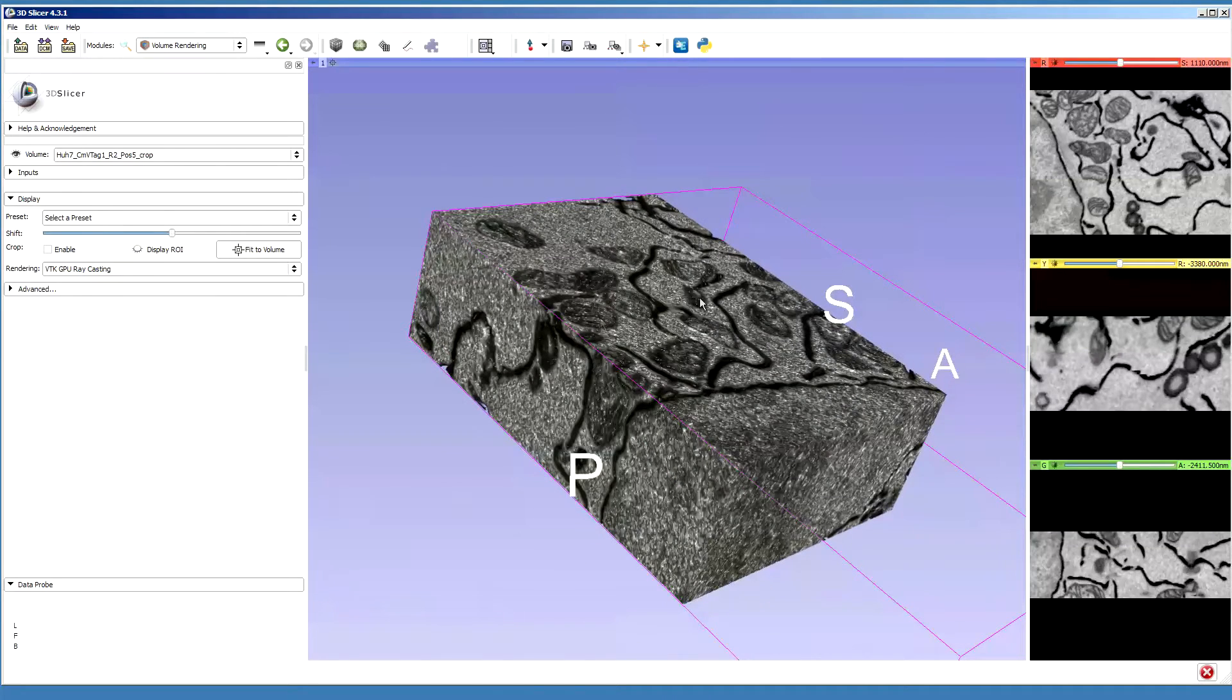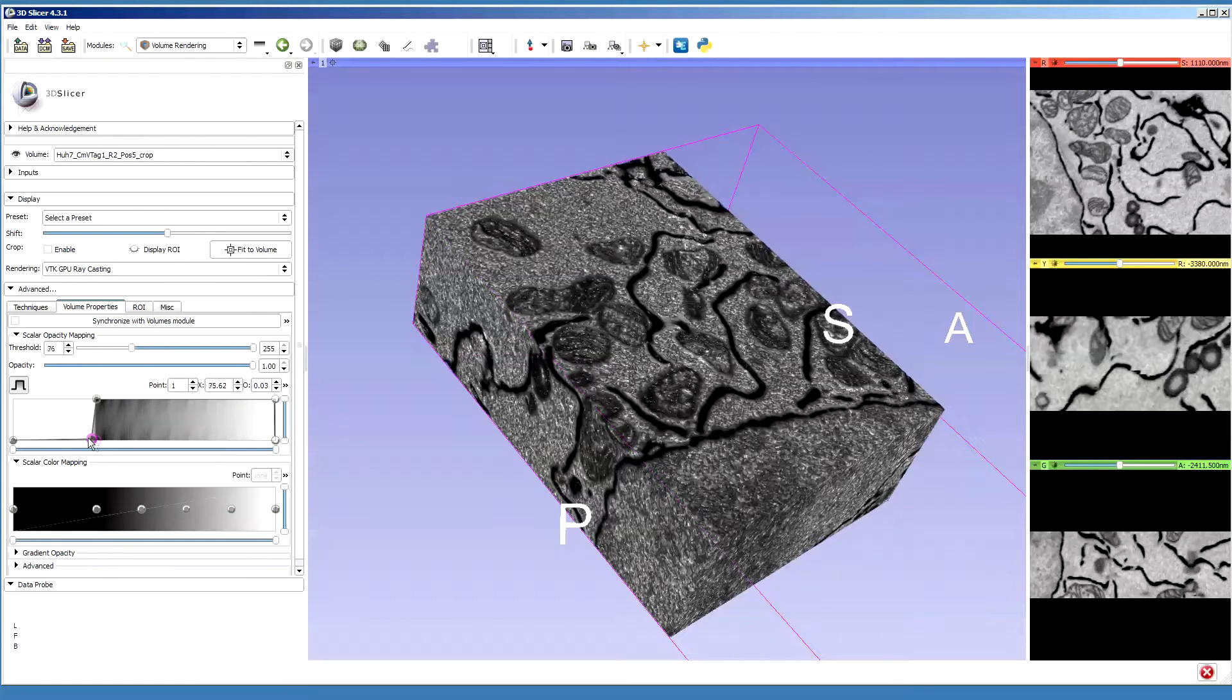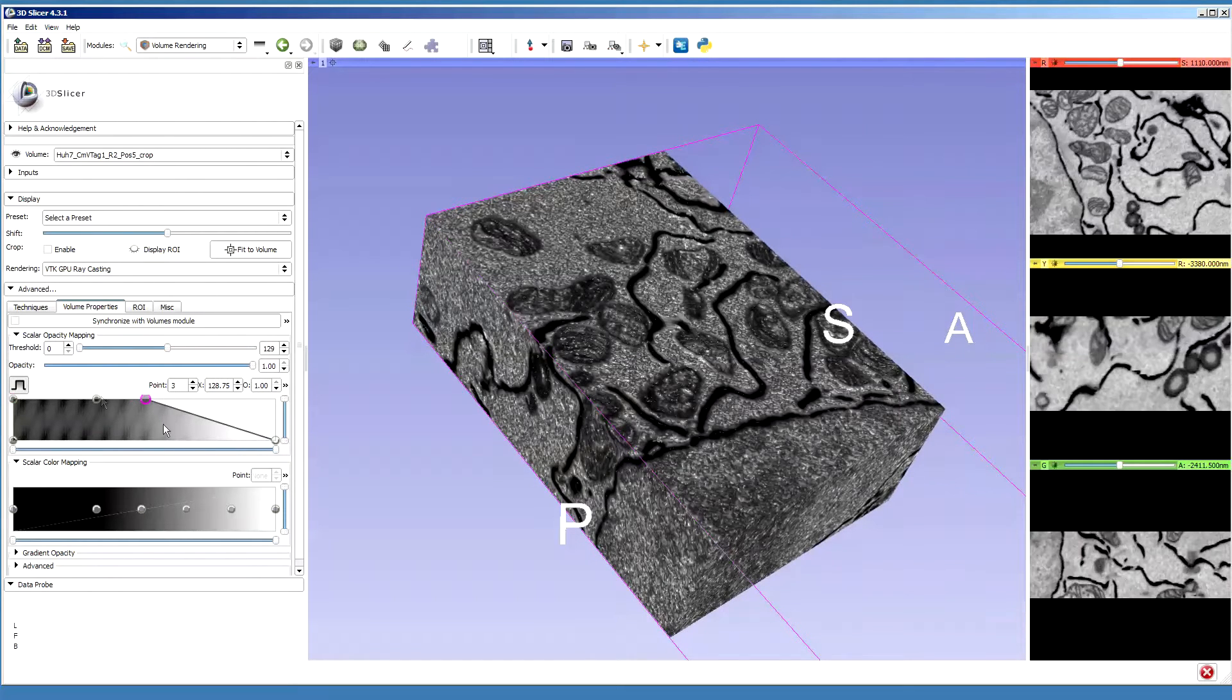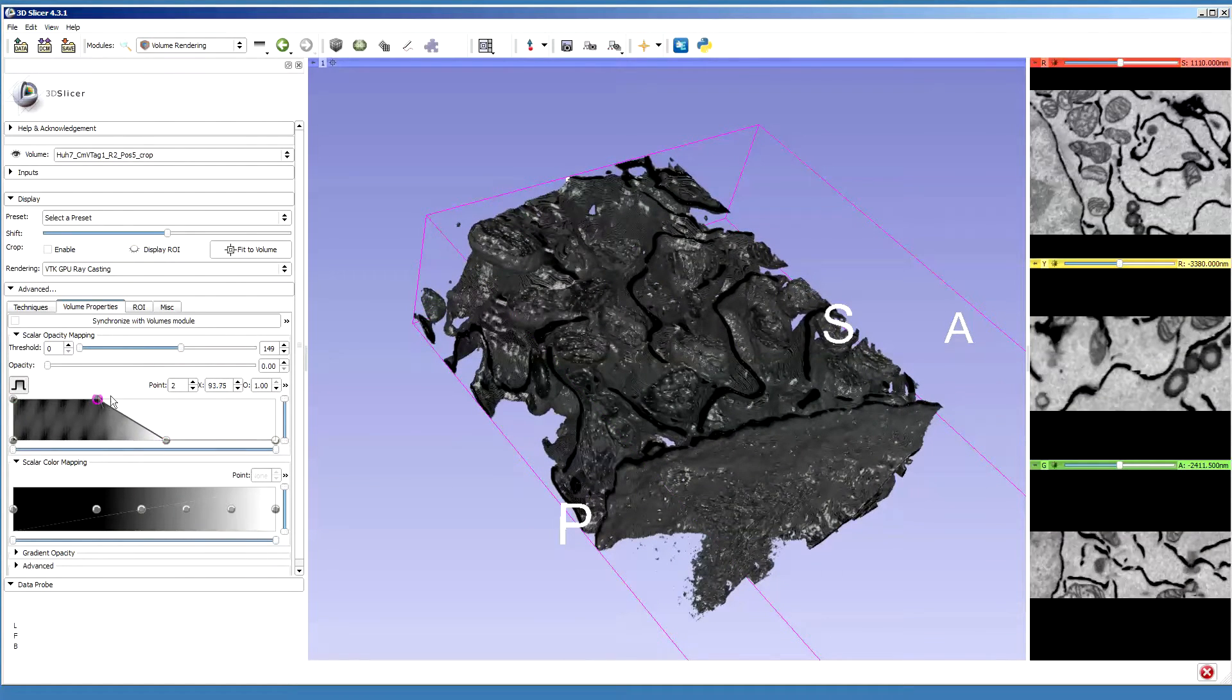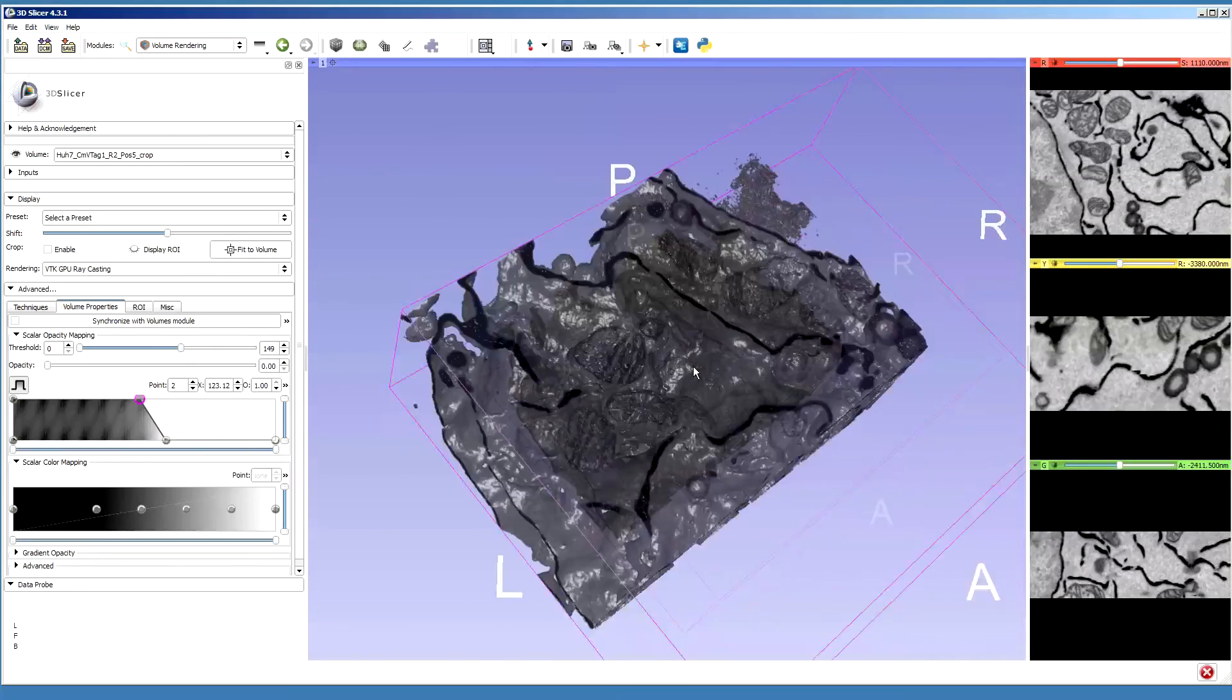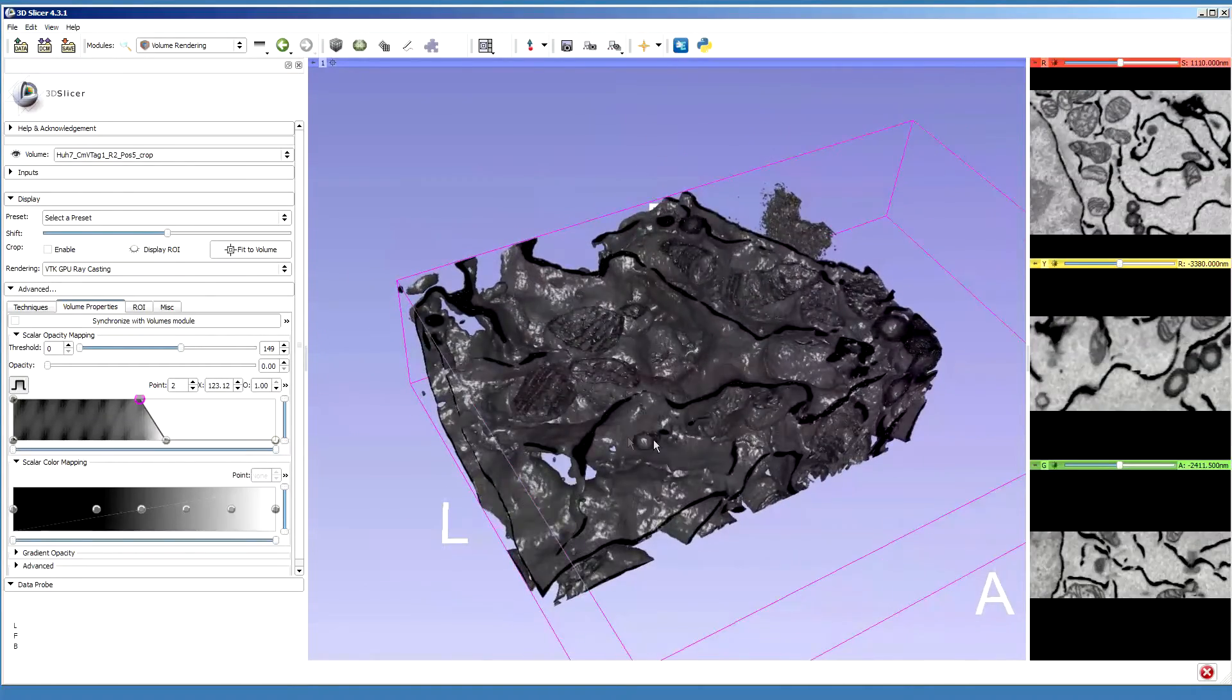Because our signal was black, it actually looks a little bit inverted, so we need to change the transparency for this volume, and that can be done in this advanced tab. I click on this button here and modify the transparency curve so that the lower intensities are opaque and the high intensities are transparent. Just by moving the sliders I can find the threshold value so that the dataset is shown in the best way. Now we can see the volume we used for modeling.